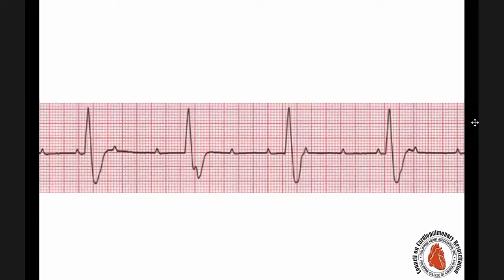All right. This is another example. So look at this PR interval, and the PR interval here and the PR interval here. Magkakaiba sila. So there must be something wrong. If you look at this drop beat, the PR interval here is different from the PR interval here. Parang pwede siyang second degree AV block type 1, pero di ba sa second degree AV block type 1, the PR interval before the drop beat should be longer than the PR interval after? Ito, baliktad na siya eh. Mas mahaba na after. It does not follow the criteria for a second degree AV block.